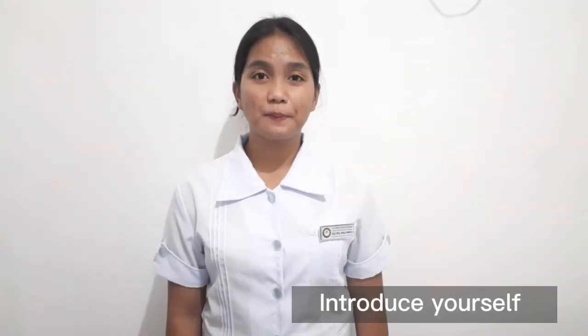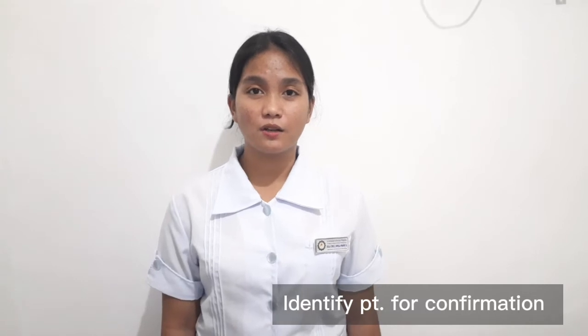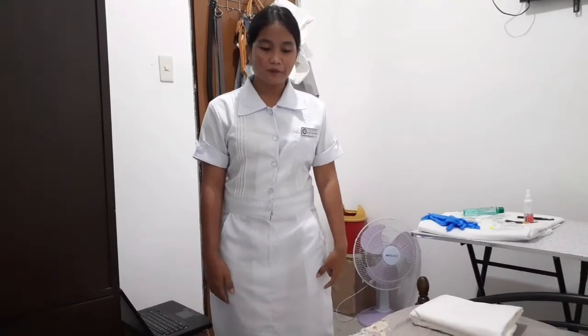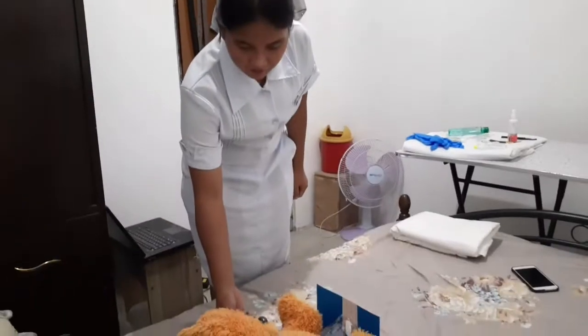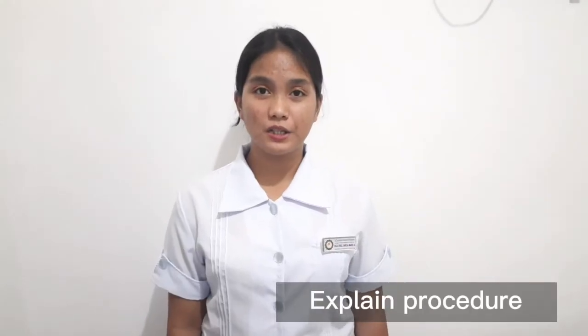Introduce yourself to the patient. Identify the patient by the two identifiers, which are the name and birthday. Hi ma'am, I am Sheila Marie de la Cruz, your nursing assistant for today. But first, will you please state your name and birthday for me, please? Okay, thank you, Ms. Santos. Then, explain the procedure to the patient.